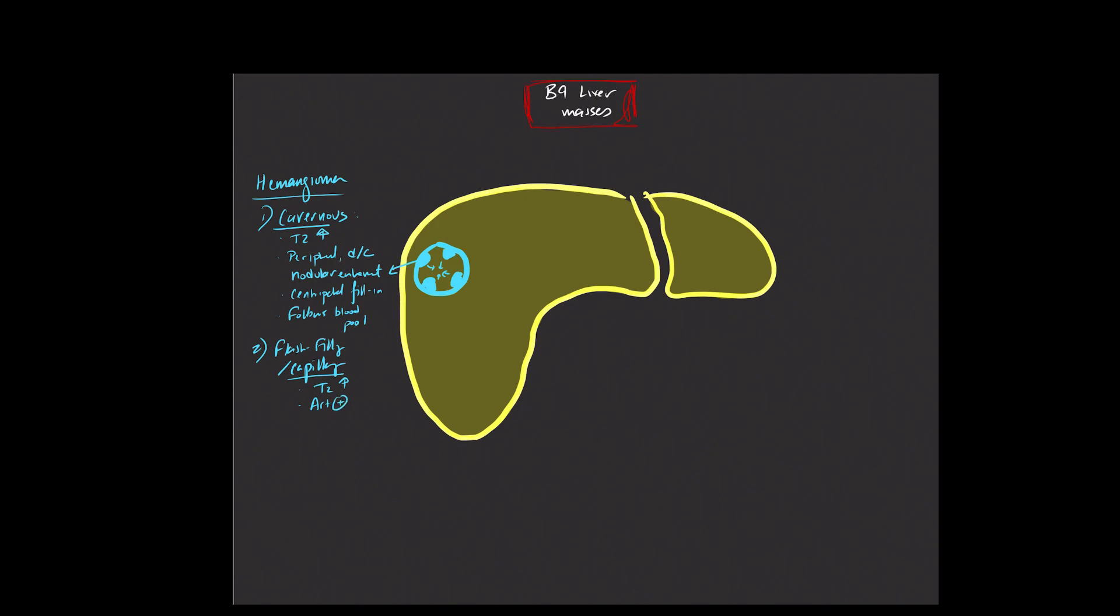On the remaining phases, they'll follow the blood pool, but these will be a more homogeneous enhancement, not that peripheral discontinuous enhancement. These often end up being smaller lesions, typically less than two centimeters in size.